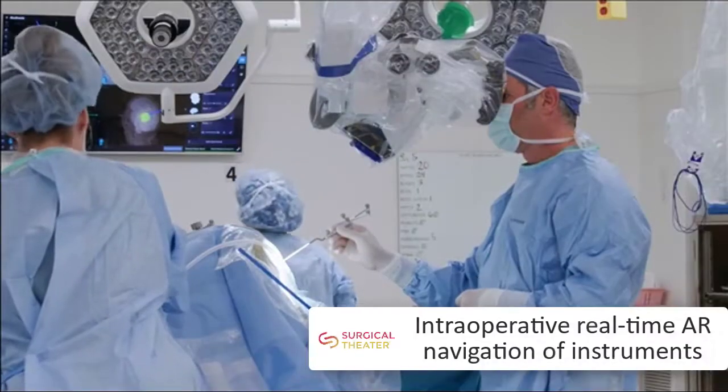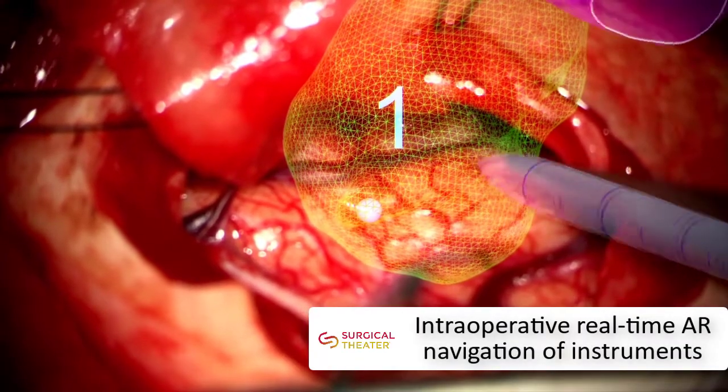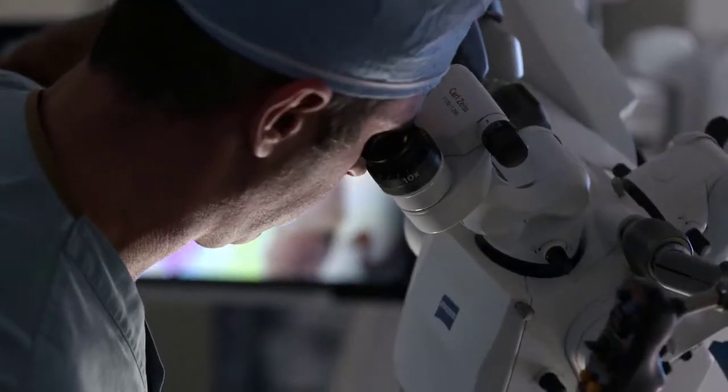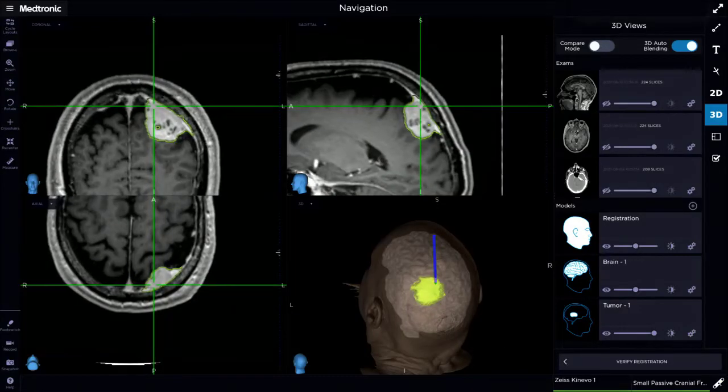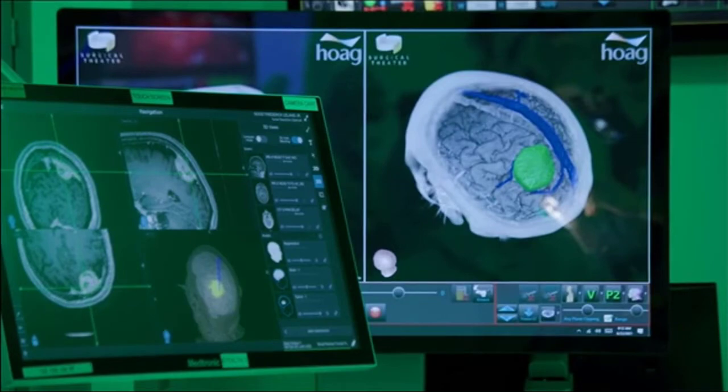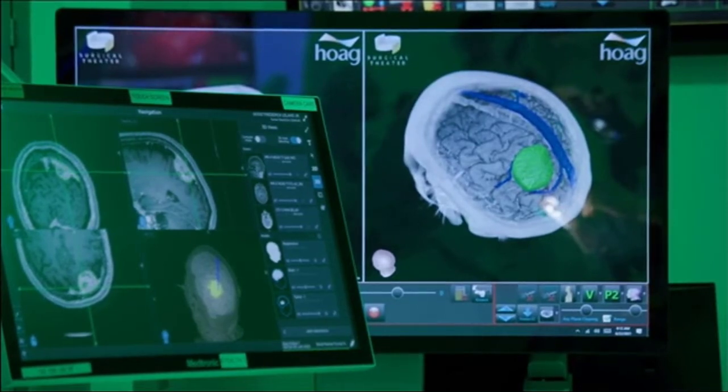Sync-AR tracks your tools during surgery, displaying a synchronized virtual probe for better visual awareness. In collaboration with surgical navigation, Sync-AR provides an integrated experience that is setting a new standard for how neurosurgery is performed.